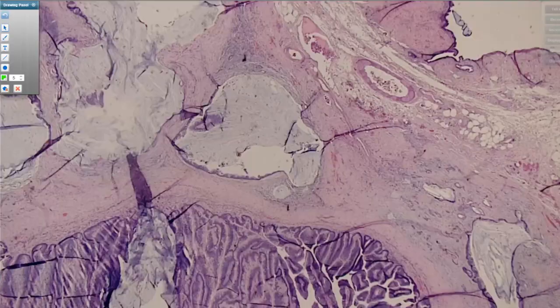Here's an area where you have incomplete glands lined by mucin, which is very suspicious for invasion, but you can certainly have IPMN within a normal side branch duct that then ruptures. It gives you an incompletely lined area. So to me, it's not definitive. It's tough, however, to make much sense here of a normal duct structure.